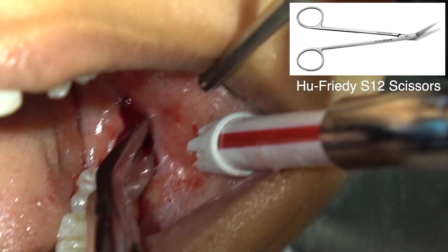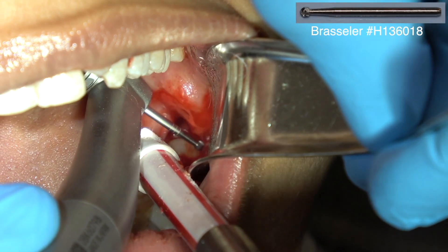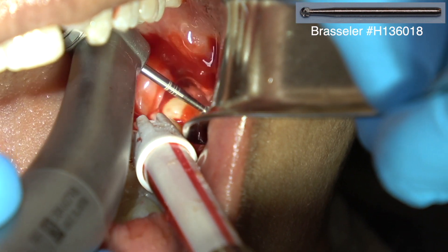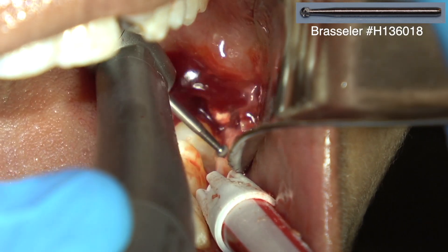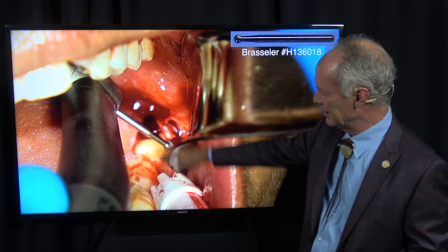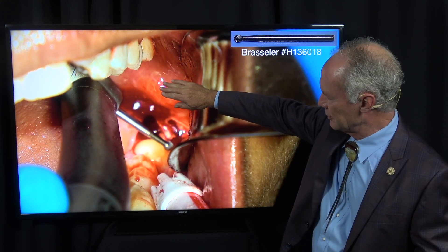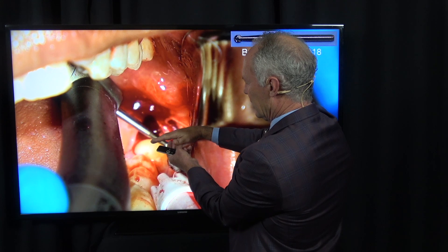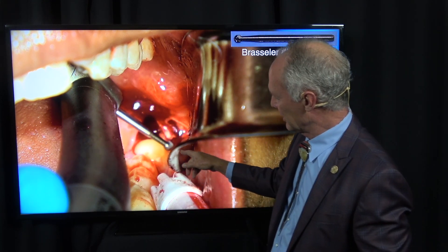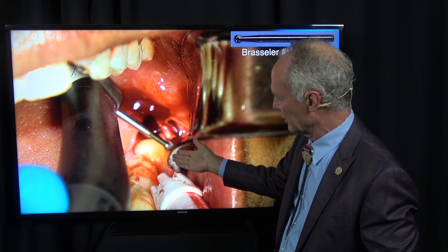Dr. Lamar Bird taught me the distal wedge method when I was in my oral surgery fellowship — use it when extracting a terminal tooth in an arch. Using scissors, we cut up the ramus of the mandible and reflect only the flap on the facial side, keeping the flap in attached gingiva. With about a number four or six round burr, you've got to create a little space on the distal of the tooth so you have somewhere to move it into.